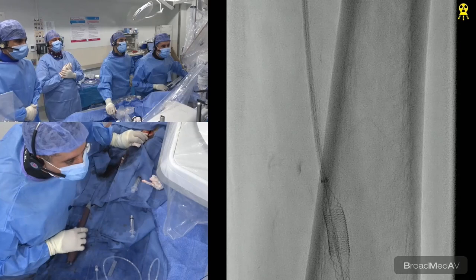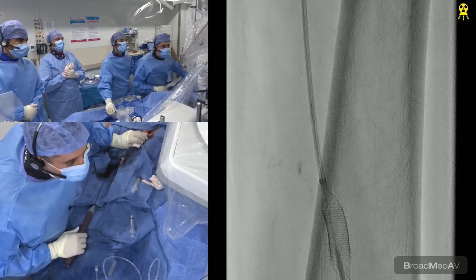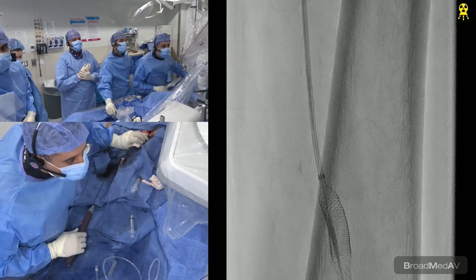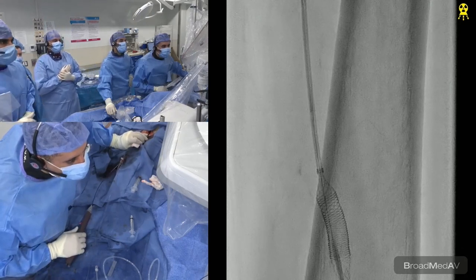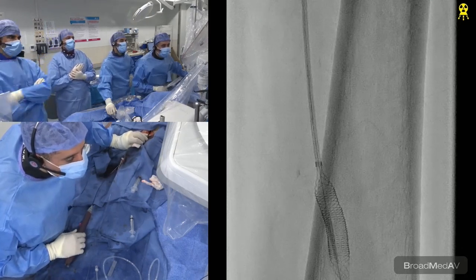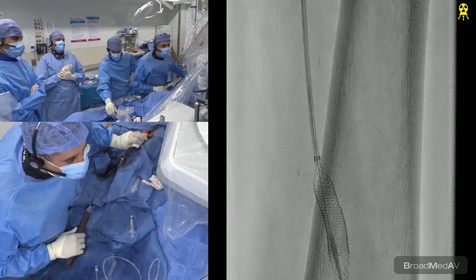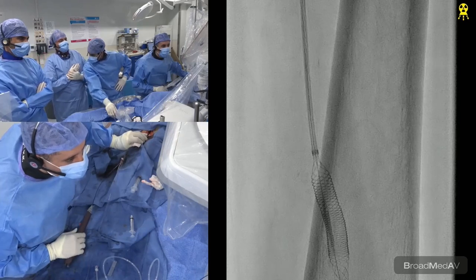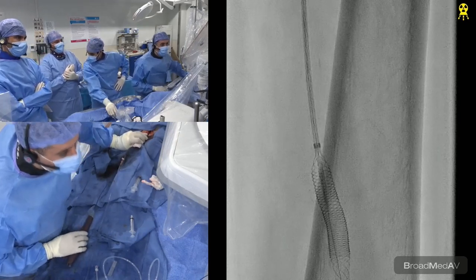People worry about stacking versus elongation. I don't worry because these stents, once they're prepped well, will do really, really well. You could see that it's not going to elongate. You see how easily it's deploying. The distal is a little elongated, which I told you is going to happen. But I think over time this is going to straighten out, at least in our hands, as we've seen these patients come back.